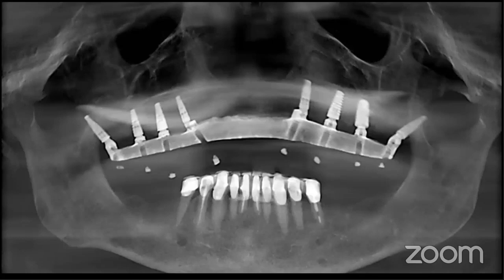But in this case, we did two large sinus grafts, and we're placing implants into that sinus bone, but that's regenerated bone. And at best, you see we have very good lifts, very high amount of bone growth, but at best, we're getting about type 3 bone. So it's not very dense bone.